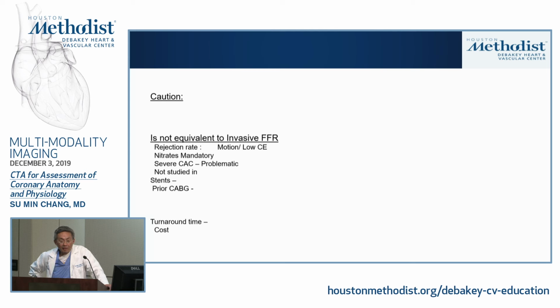Our case is probably around 20%. In other centers, it's a little bit less. In the European studies, they quote about 10-15%. You need to give nitrate, okay? So we cannot use it in our TAVR protocol, right? Because we don't give nitrate in our TAVR protocol.